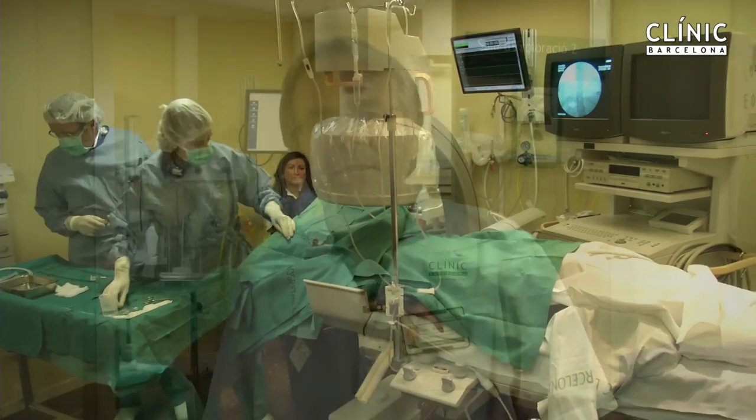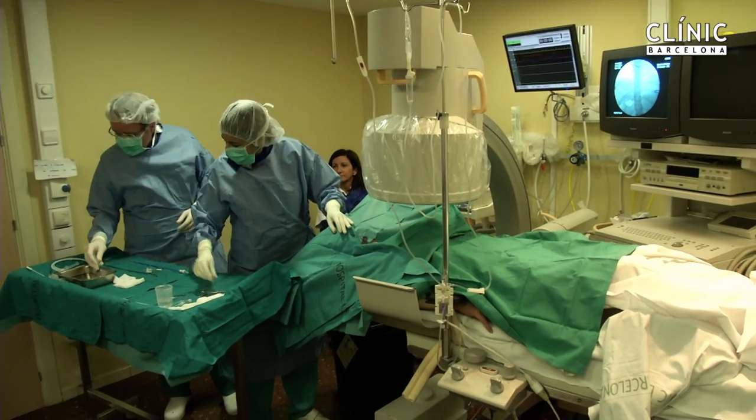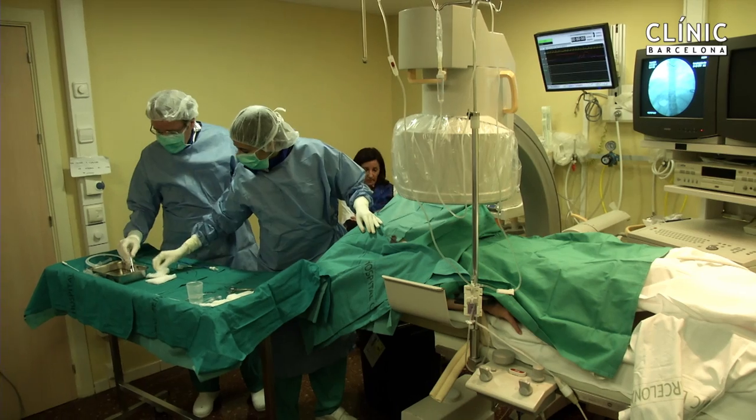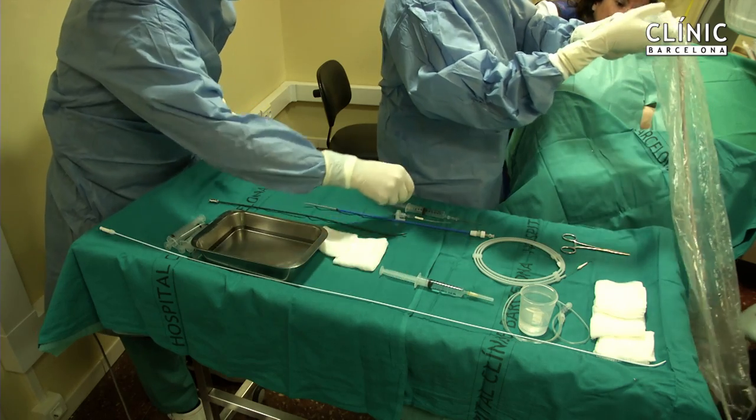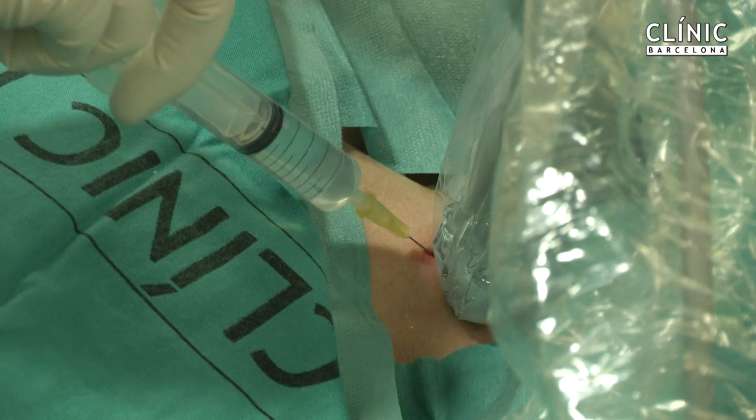The following video shows the technique used at the hepatic hemodynamic lab at Hospital Clinic in Barcelona, presenting the evolution of our experience in more than 500 procedures performed under local anesthesia and aseptic conditions.